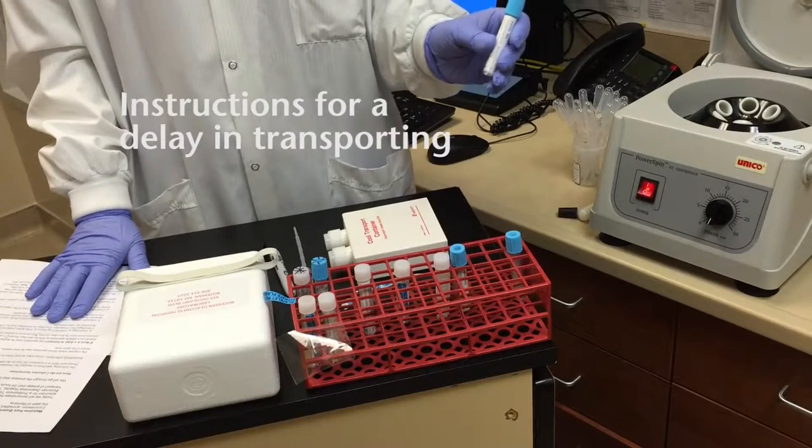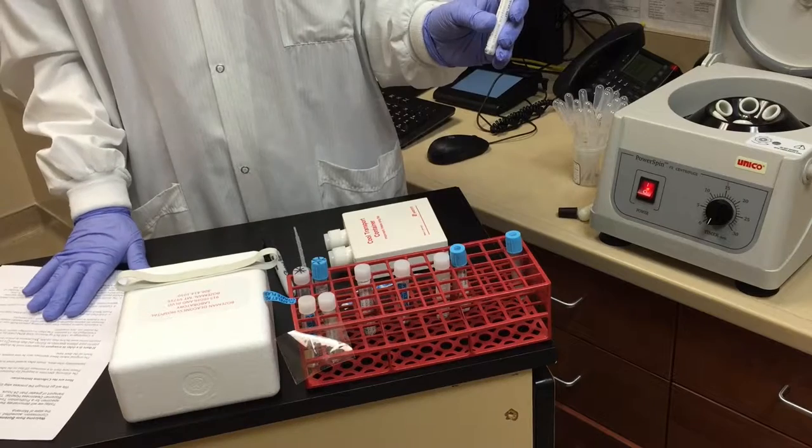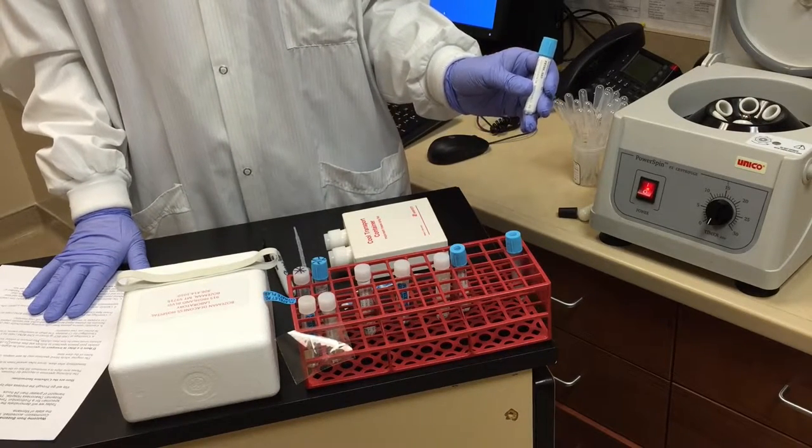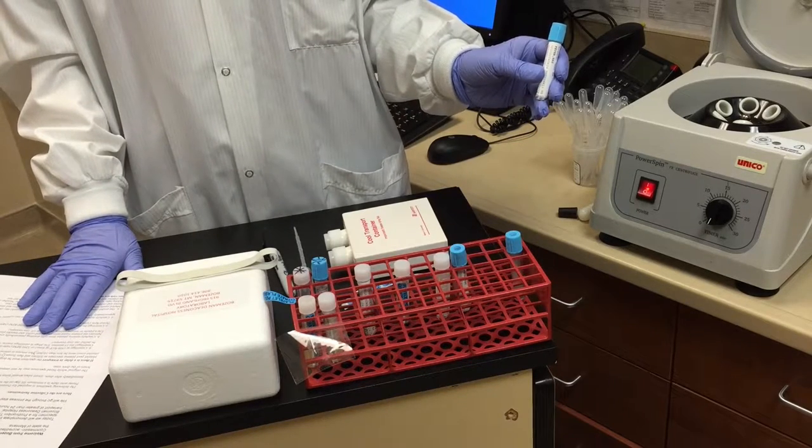If there's a delay in transport, the specimen must be double centrifuged in order to prepare the platelet-poor plasma specimen and then frozen. This process is critical for accurate results.